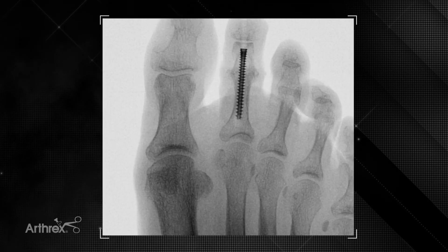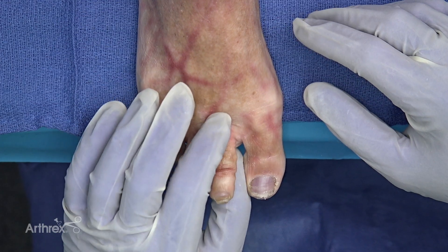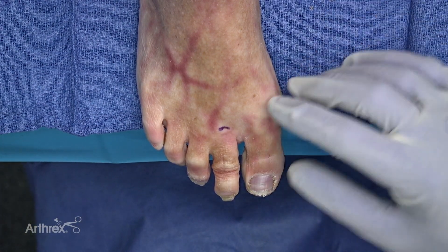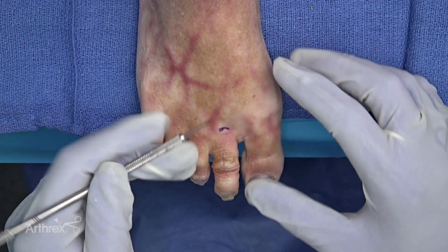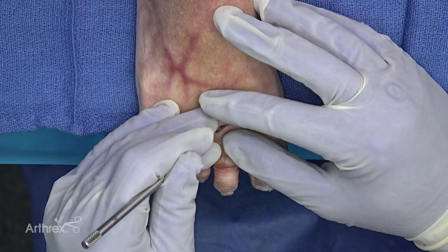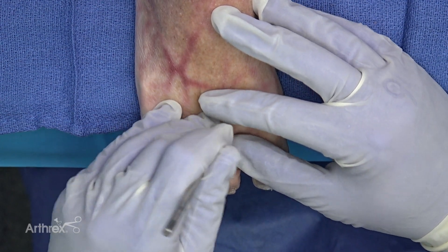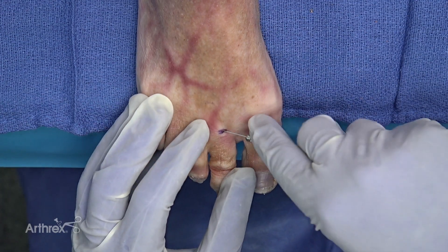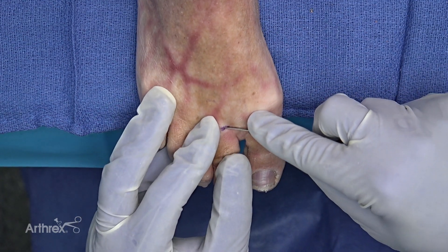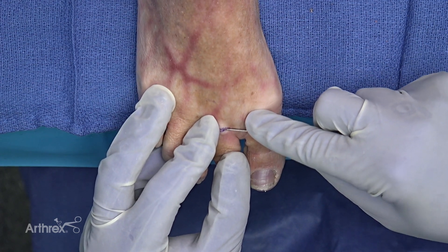There's your final fluoroscopic image in the AP plane and here's your image in the lateral plane. Frequently with a hammer toe deformity I'll perform a metatarsophalangeal joint release. I'll either palpate the joint or mark it using fluoroscopy. I'll take the beaver blade and go almost directly into the joint, cut the long extensor, and then also cut the short extensor, putting some gentle plantar flexion pressure on the toe — you feel a satisfying release once you've been through the tendons.